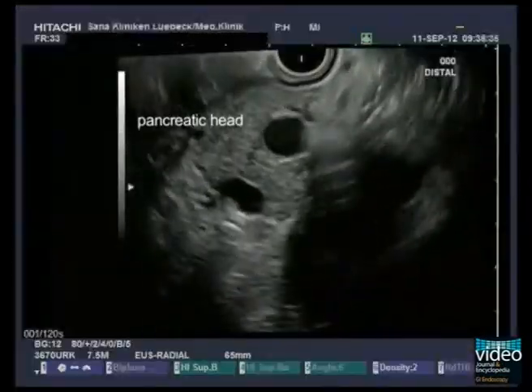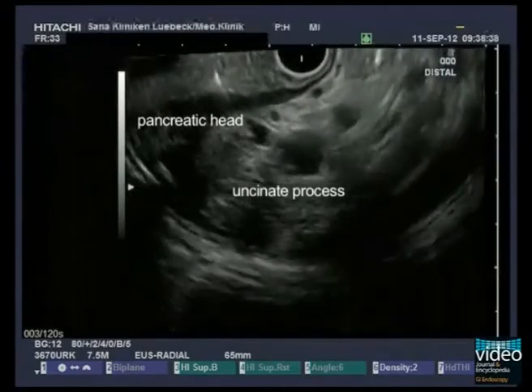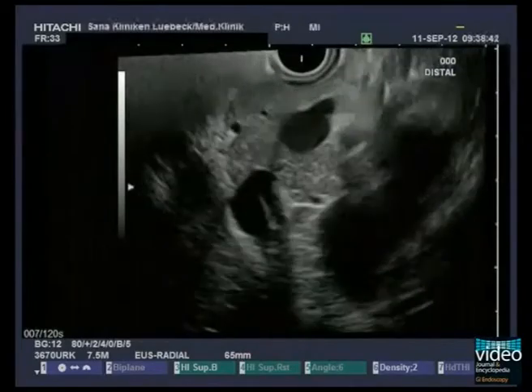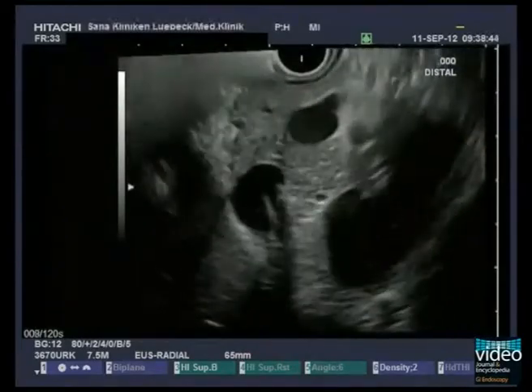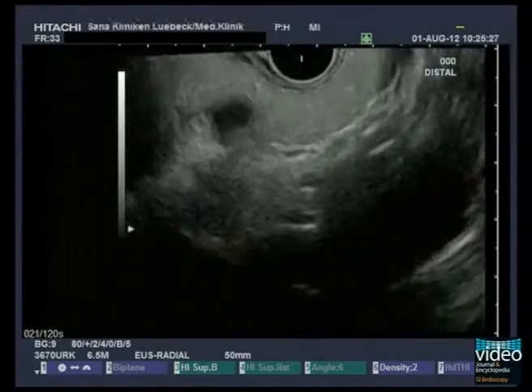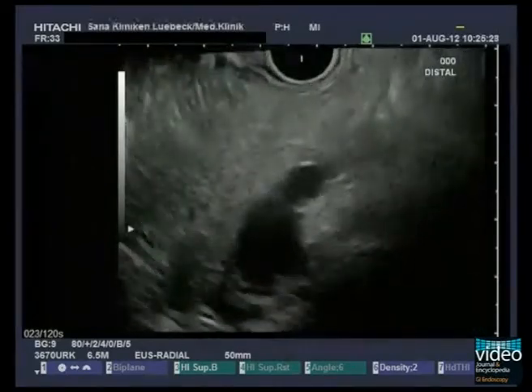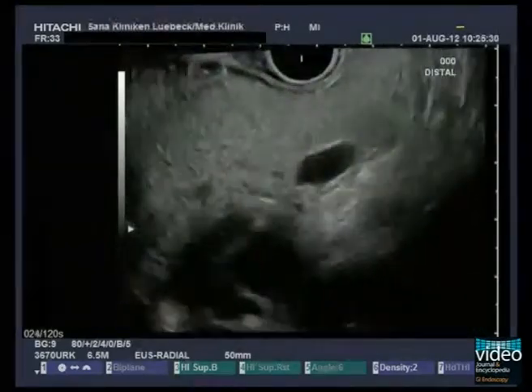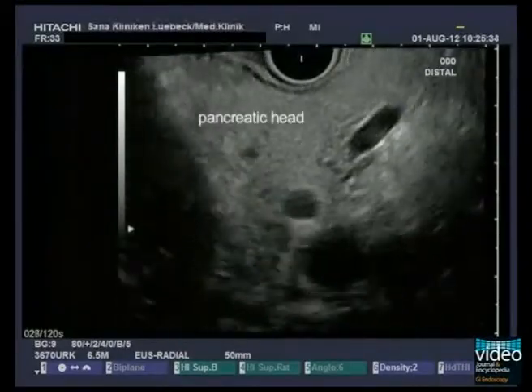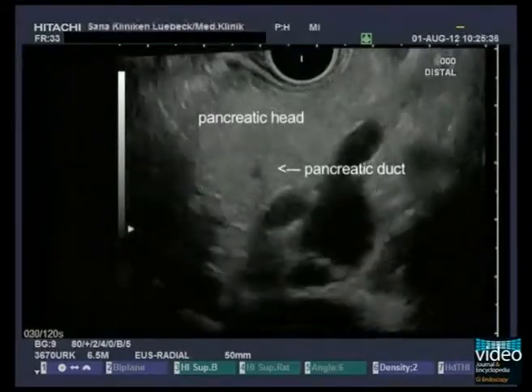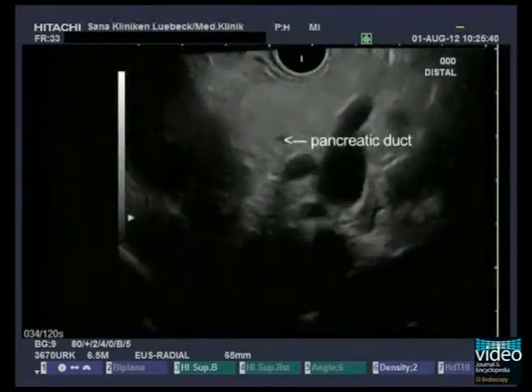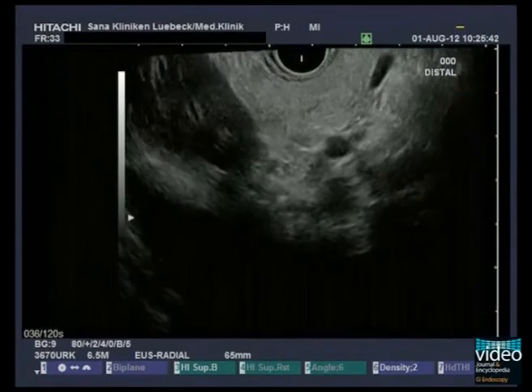Parts of the pancreatic head and of the uncinate process are observable in front of and behind the confluence respectively. If the transducer is now turned further to the left, laterally to the confluence, the pancreatic head, which encircles the confluence, can be shown. The caudally running pancreatic duct can be seen in cross-section.